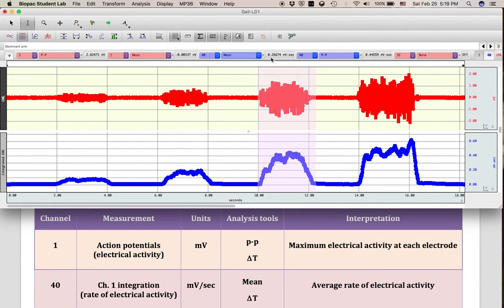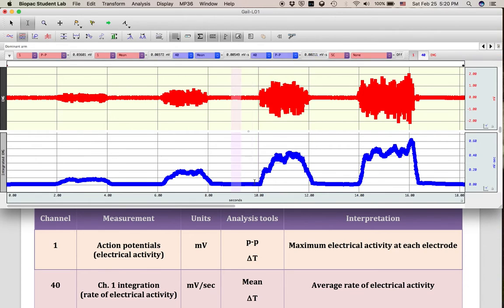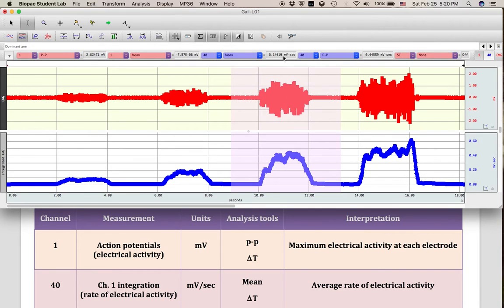We should have an average of roughly 0.27, but if I extend this into the tonus regions before and after the clench effort, it dramatically drops my mean because we're putting zeros into our mean.